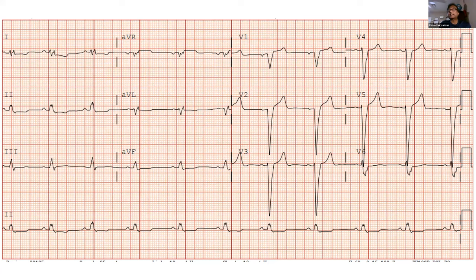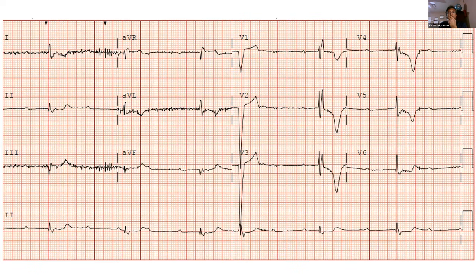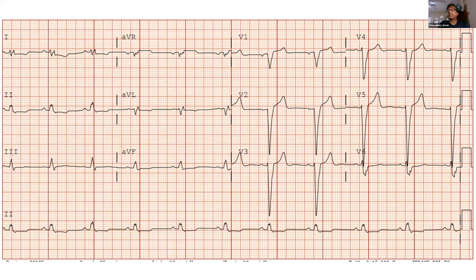Excellent point. The next level of question. That patient's heart rate, with the temporary wire and then off beta blocker the following morning, was this. Sinus rhythm, left bundle. And I'll tell you what we did. Escape rhythm was right bundle. Right, good observation. So there is a chance that he would be paced, and then the alternate bundle. So we actually went for BIV pacing, but not ICD.